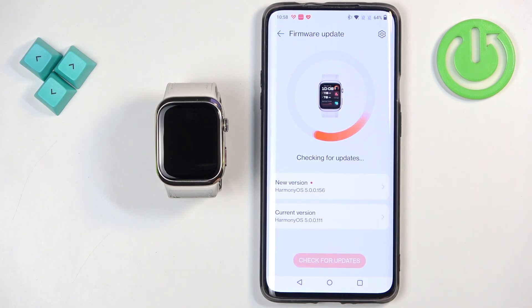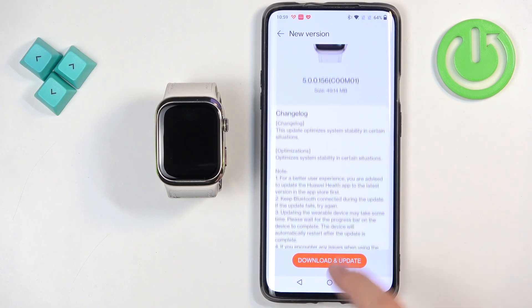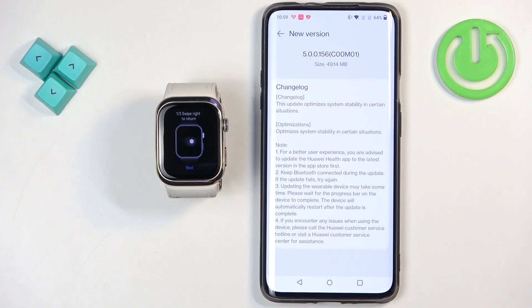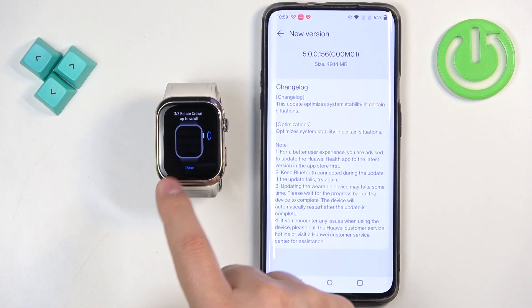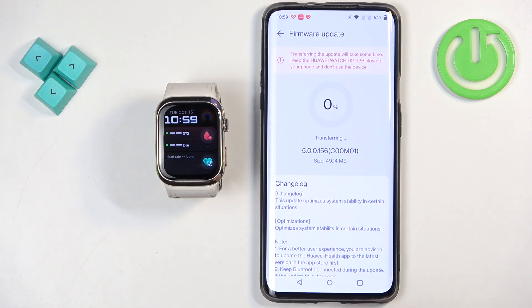The app is checking for updates. Once it's done and it detects the update, you will need to tap on Download Update. It's going to start downloading the update, and once it's done downloading, it will start transferring it to the watch. After that, it will start installing it. It might take some time, so let's wait.